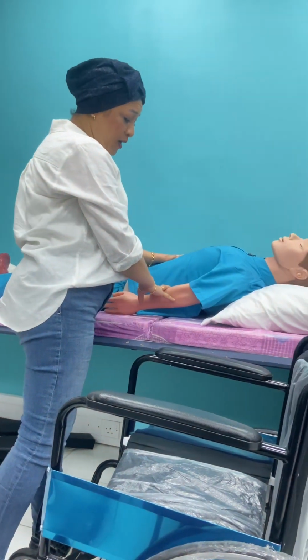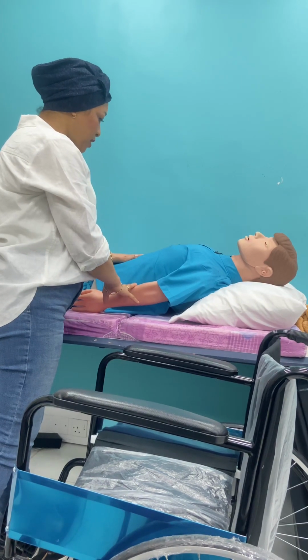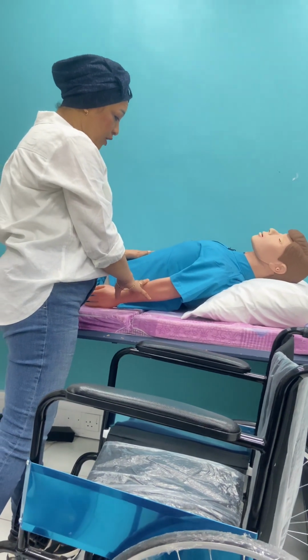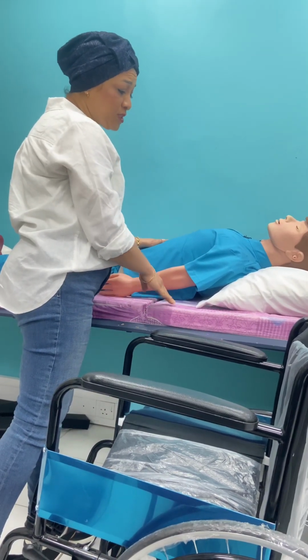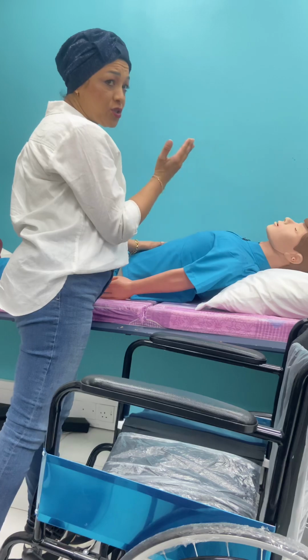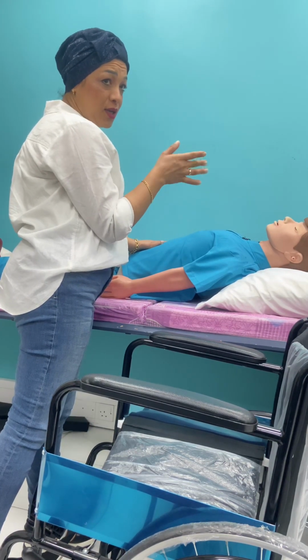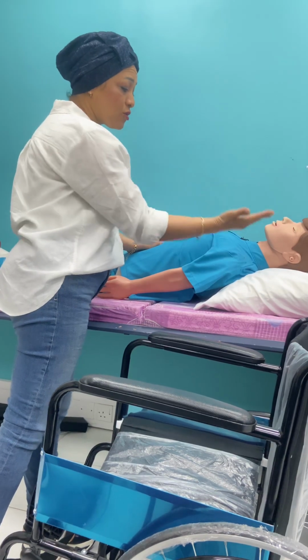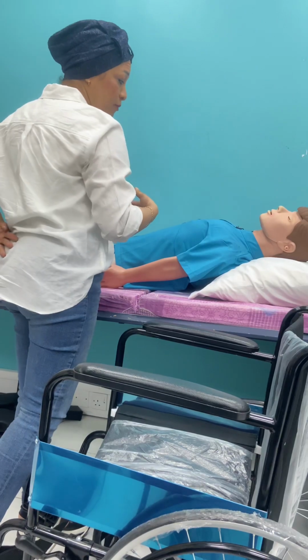And then I talk to him. I ask him to cooperate. So, Mr. Mustafa, we will start now. If you can please cooperate with me. The bed can be flat, but usually what PTTs do is that they put the patient in Fowler's position. Fowler, that means he will be sitting like 30 to 40 degrees. Okay, so the bed will be up. It will help you also for safety of your back.